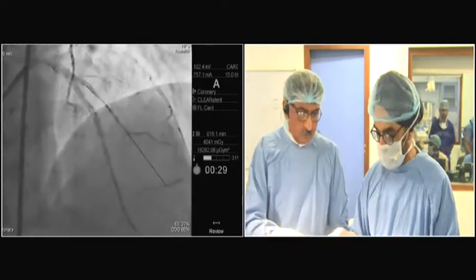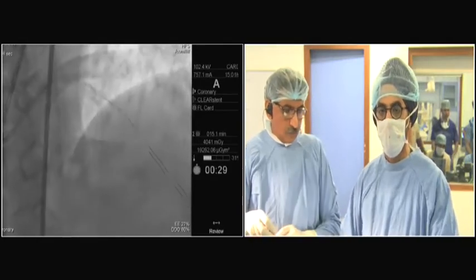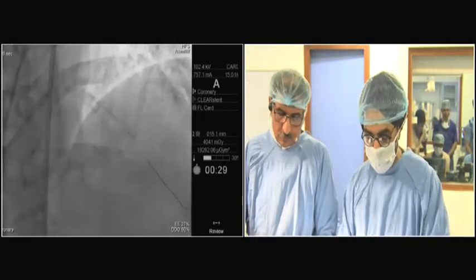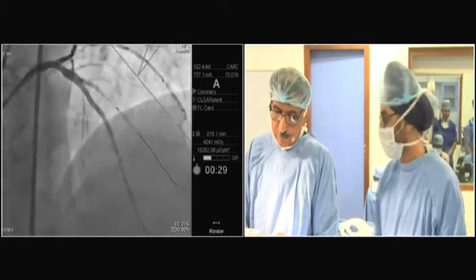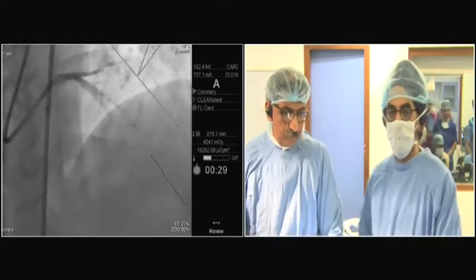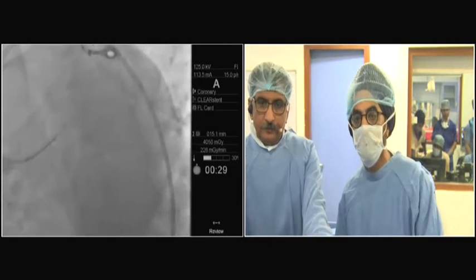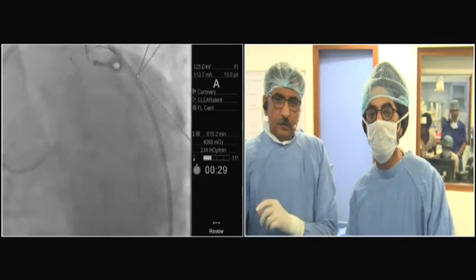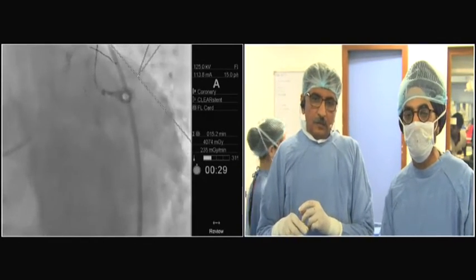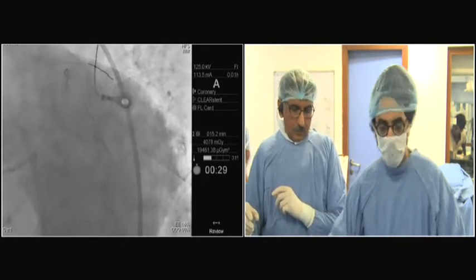Elio caudal. David, is the remaining time 1 minute? Okay, so maybe 5 minutes. So you have 5 minutes, so I'll do the IVUS before we leave you. Okay. I was ready, Guru. So you have 1 minute only. So okay, let me maybe take an IVUS. You have no time to show us an IVUS. You can show angiographic results for this very good demonstration.